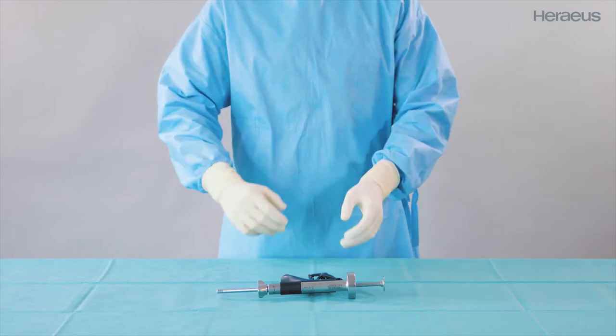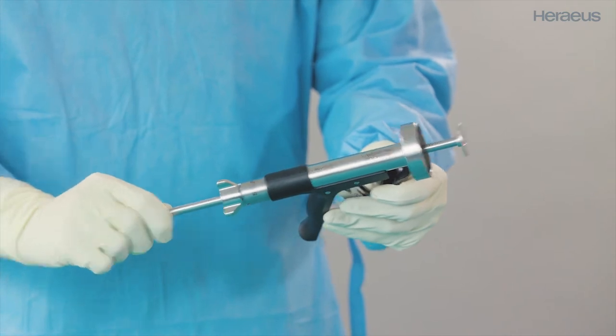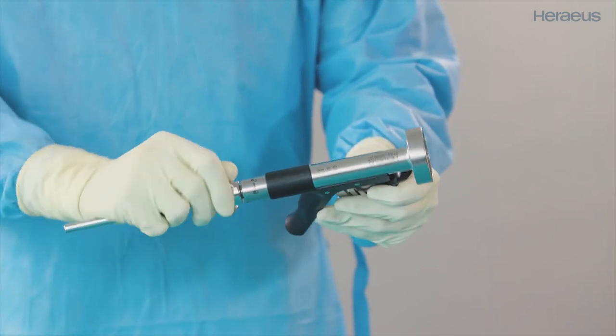First, prepare the cement gun. Release the locking mechanism and push the feed rod back to the stop. Then re-engage the locking mechanism.